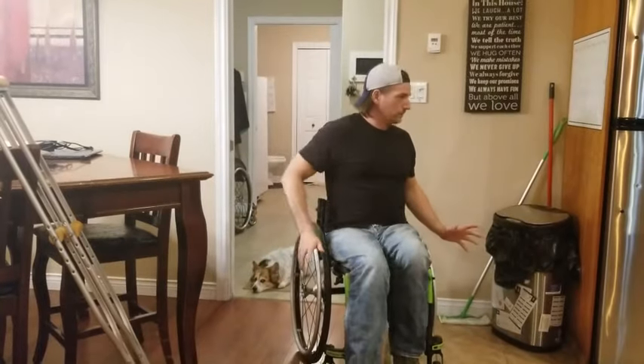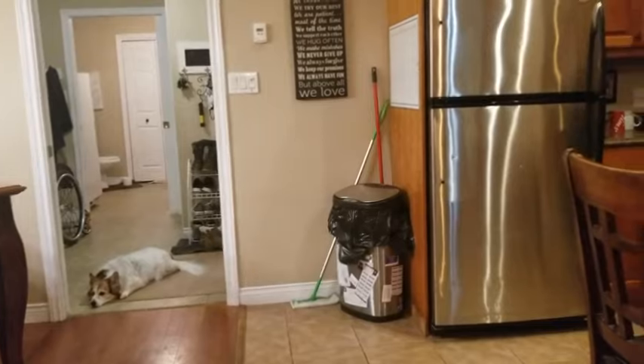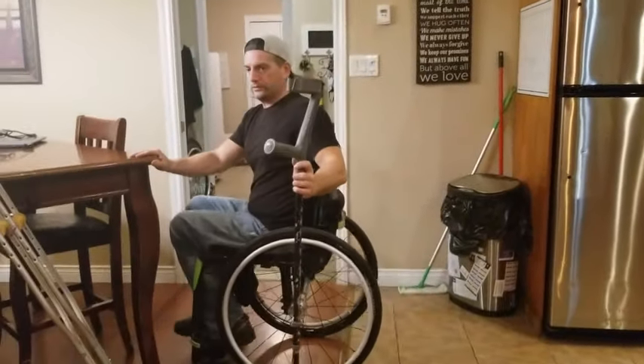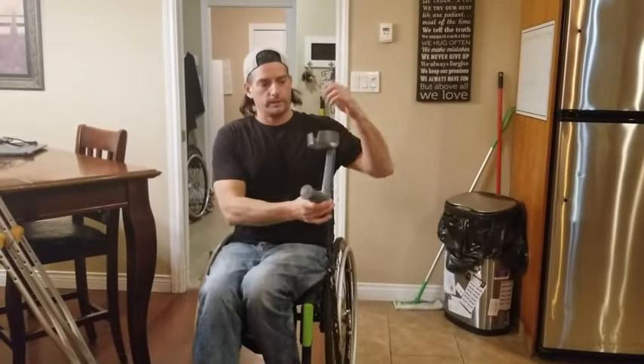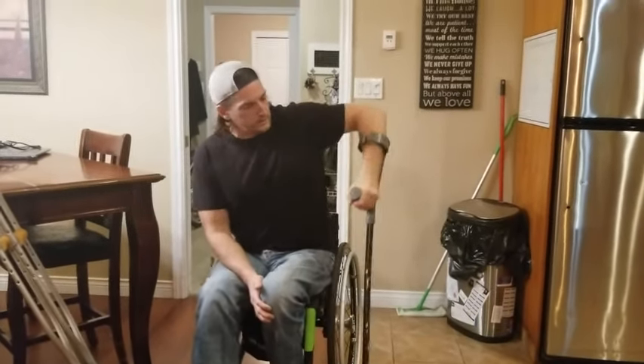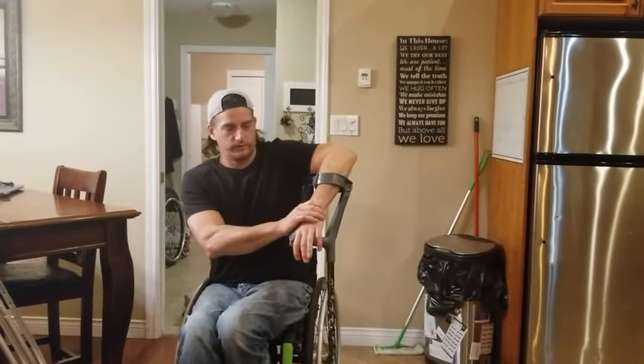Now, when I say forearm crutch, this is what I'm talking about right here. This is what I generally walk with if I actually walk anywhere. It's a forearm crutch — your arm comes in, hand grabs the crutch, and wraps it in the forearm. All the pressure goes onto your wrists.